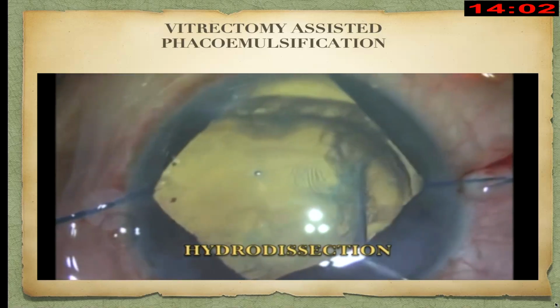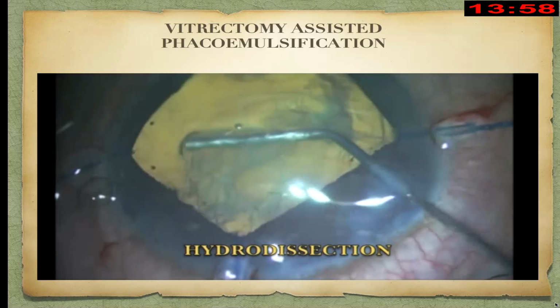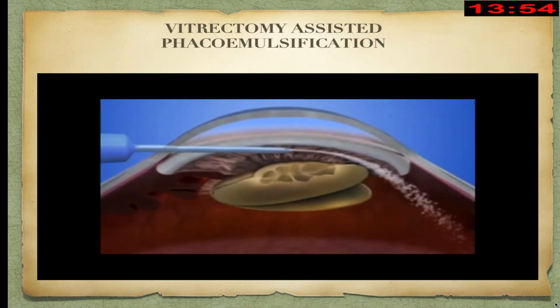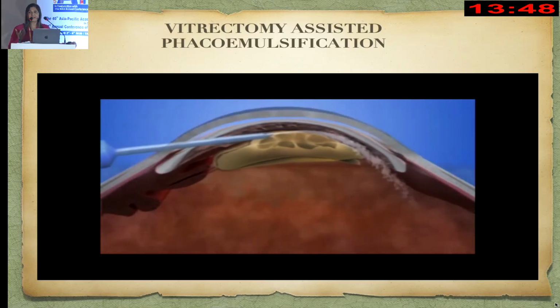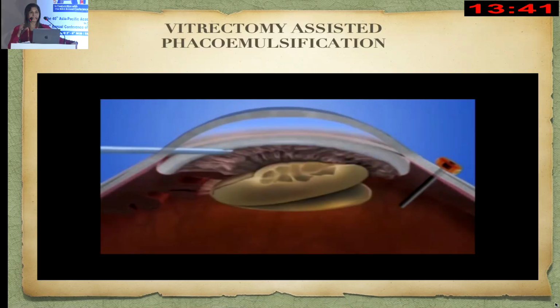So you are hydrating the vitreous at every point of time while you're doing a phacoemulsification. With the vitreous hydration coming up, you might have a bulge coming up from that area, and it manifests as shallowing of the anterior chamber when you take up these cases, when you have subluxations or you have colobomas, etc.